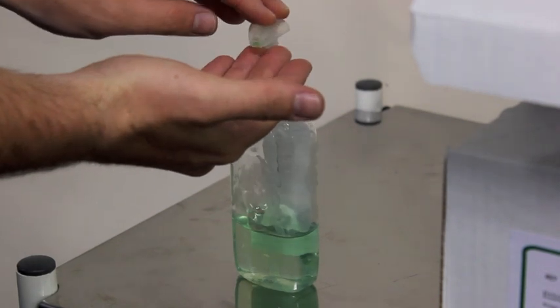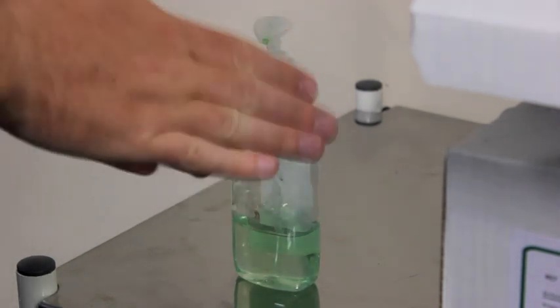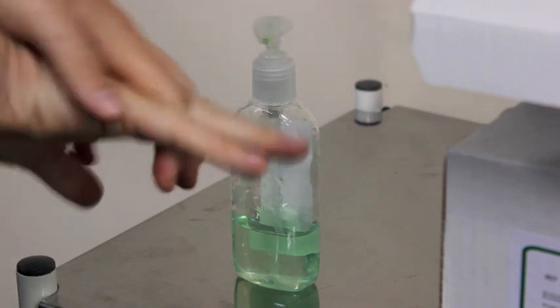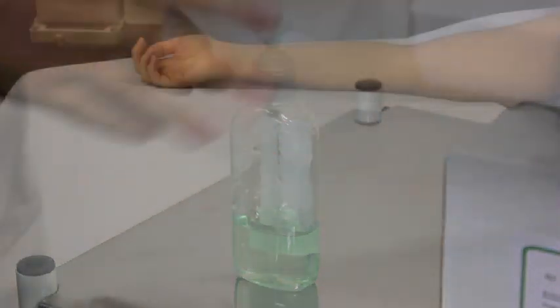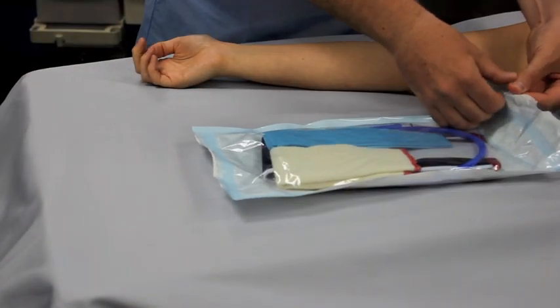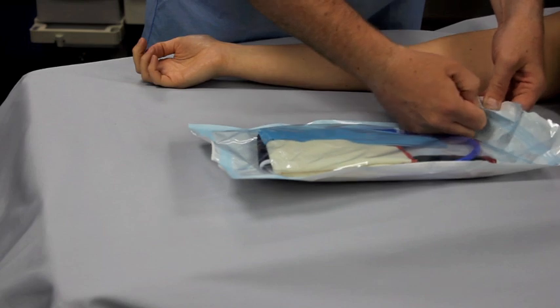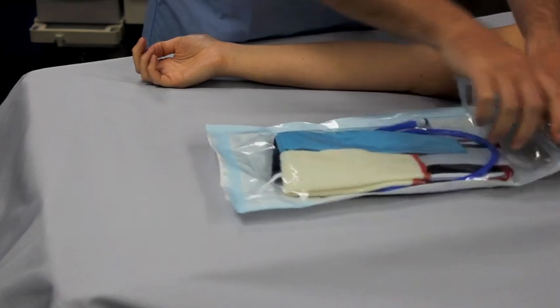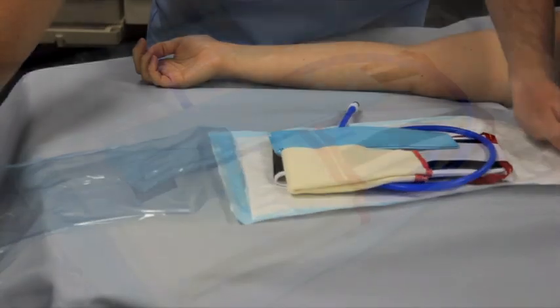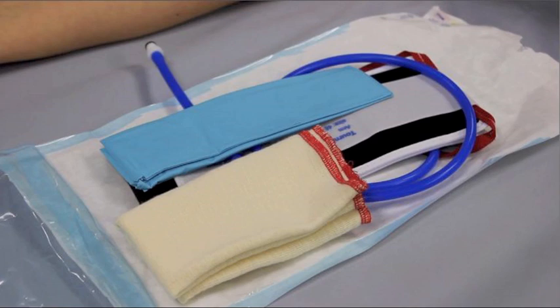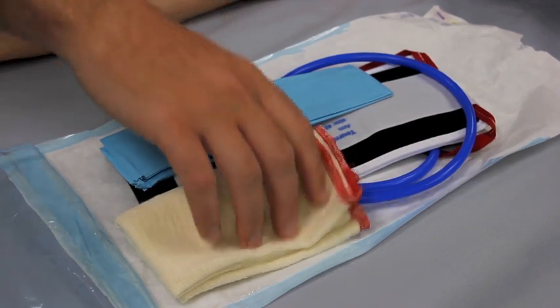Tourniquets should be applied using clean hands in order to reduce user-patient bacterial transference. The VBM procedure pack has been designed to promote best practice. The sterile, single-use packs eliminate bacterial transference between patients. The packs include all the essential items required for gold standard tourniquet placement.